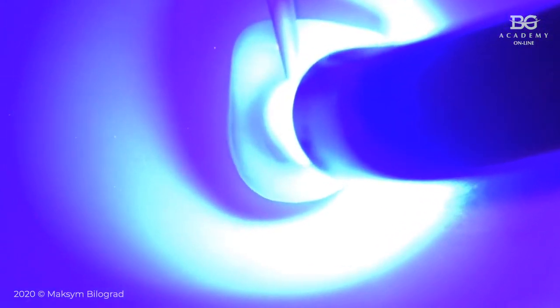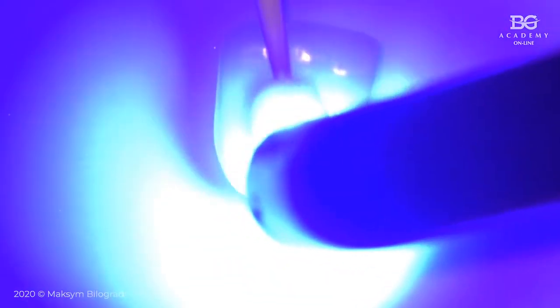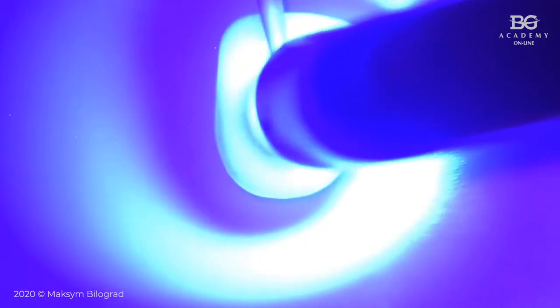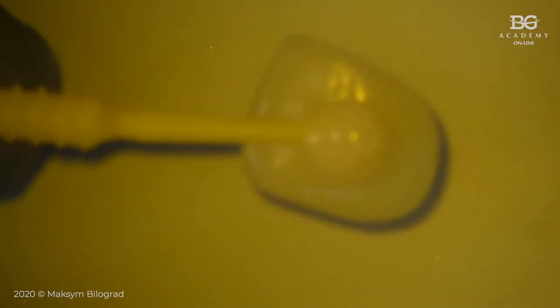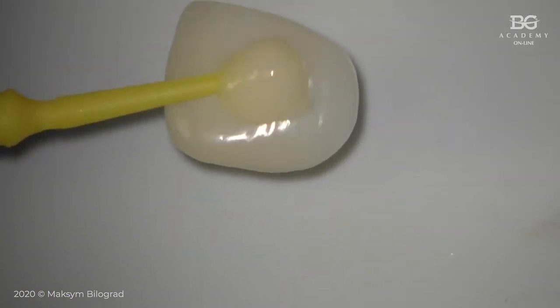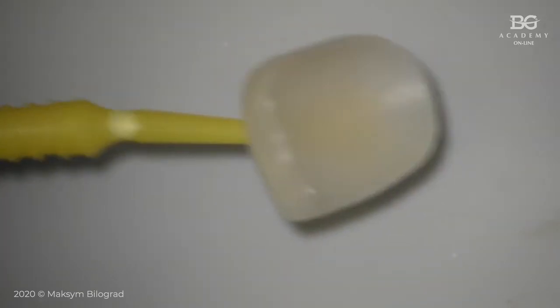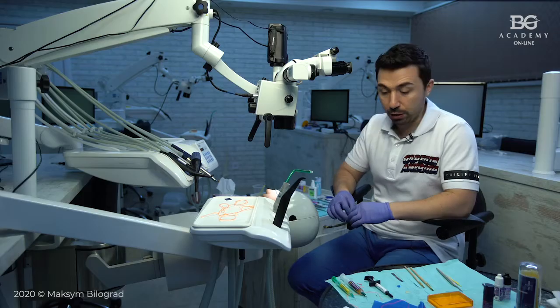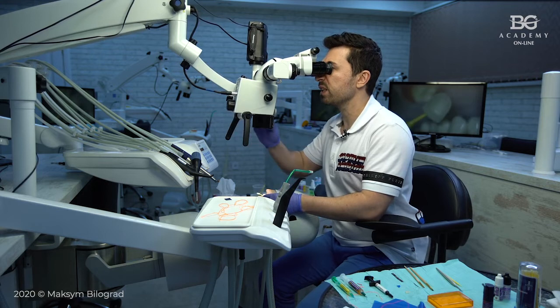You just put your veneers in Veneer Me and you prepare them with hydrofluoric acid, and you silanize them, and that's it. And then you use your fingers to put your veneers into the patient's mouth. Okay, so done. We have this holder. It can be prepared by your assistant, not by yourself, so you can use your time more efficiently. Okay, nice. So now, after this, we will do the process of etching and all the steps to prepare the surface of ceramic for bonding.